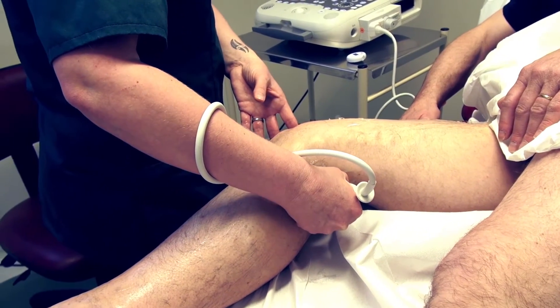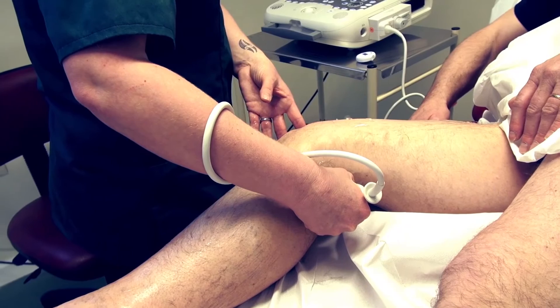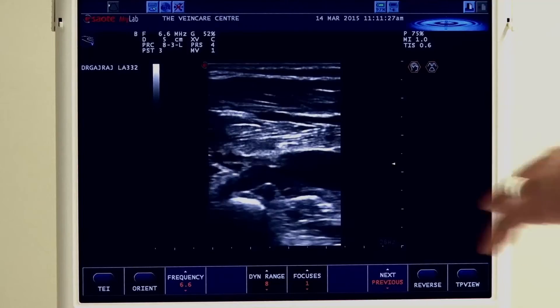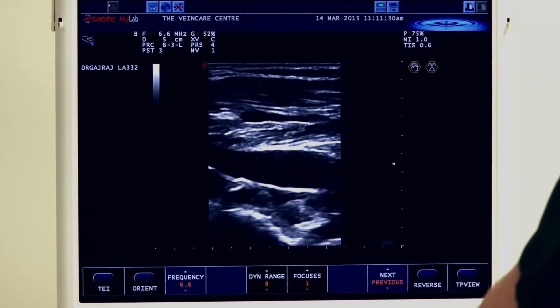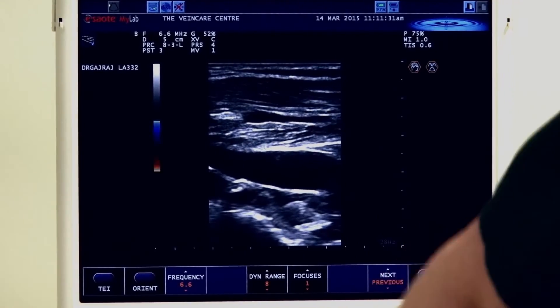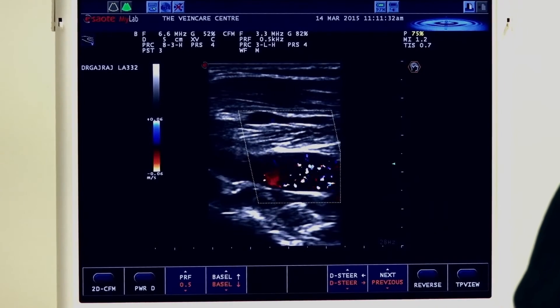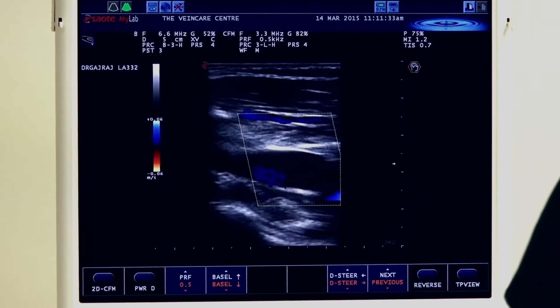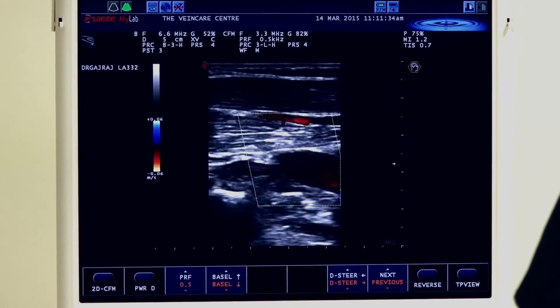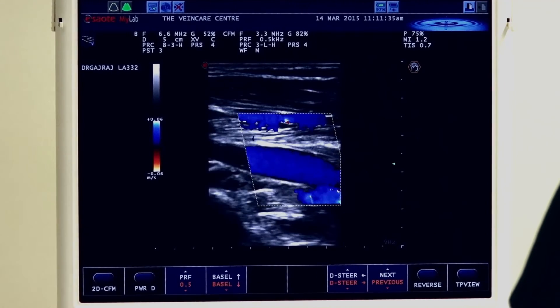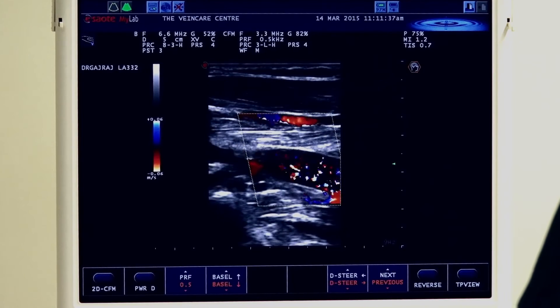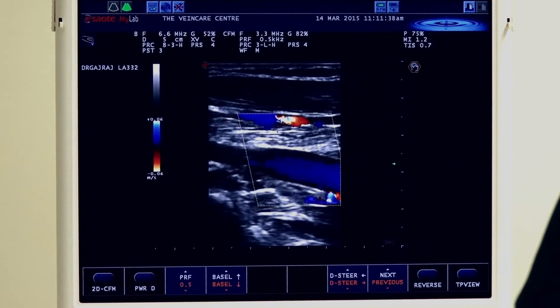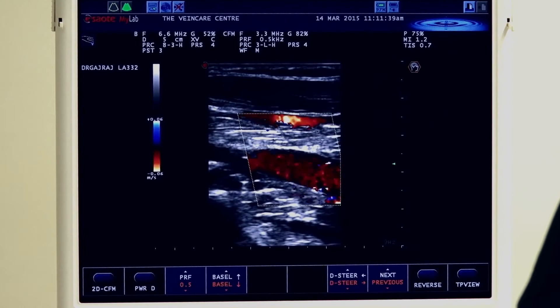Lovely compression. Turning into the longitudinal section, we can actually see a little valve working nicely in here as well. Putting our colour flow on, you can see full vessel flow within the popliteal vein.